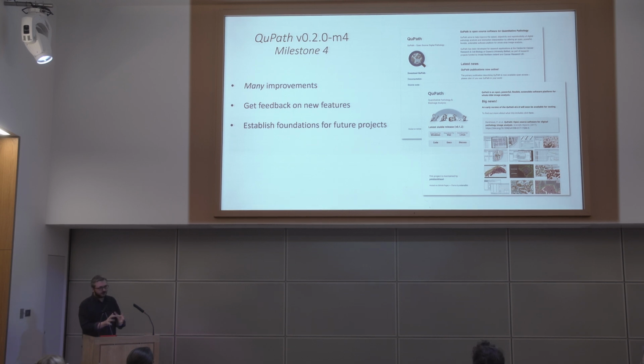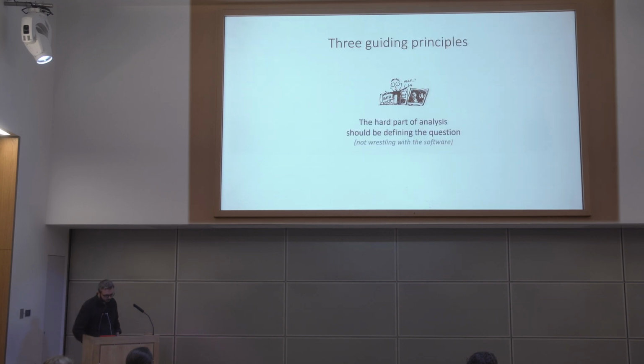But it's still in a state of flux. It's not yet a stable new release. And so if you want the stability, you probably want to go back to the version before. That's linked to in the website. But over the last few months, I've been making these milestone releases to show the direction of the project and to get feedback and try and get other people involved in it. And that's what I'll show you in a moment.